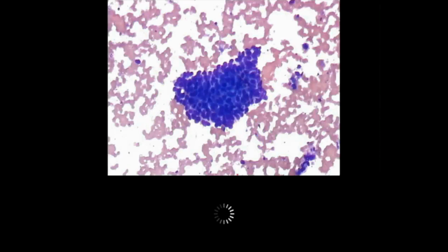As an example of a basal cell adenoma on cytology, you have these cohesive groups of basaloid epithelial cells with very high NC ratio, angulated nuclei. On morphology, this would be indistinguishable from adenoid cystic carcinoma, and we would place this in the 4B salivary gland neoplasm of uncertain malignant potential category under Milan.